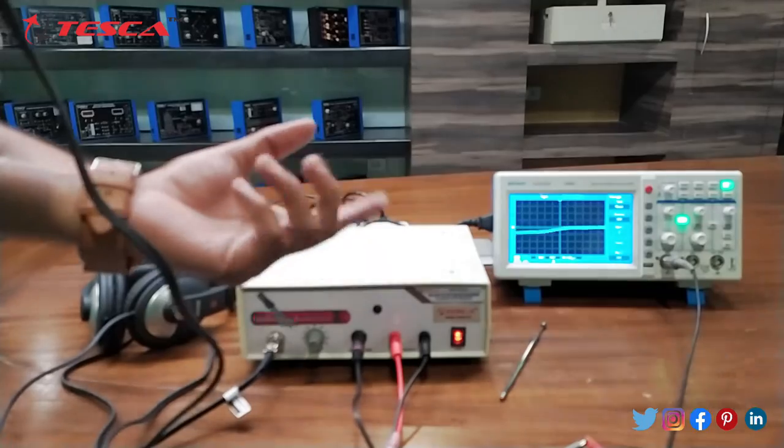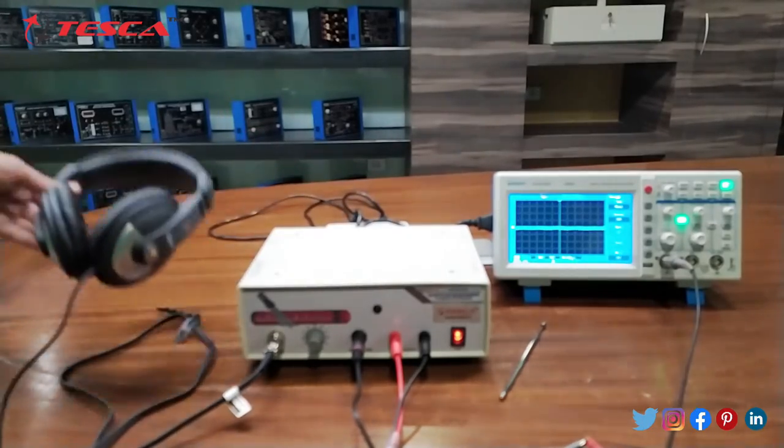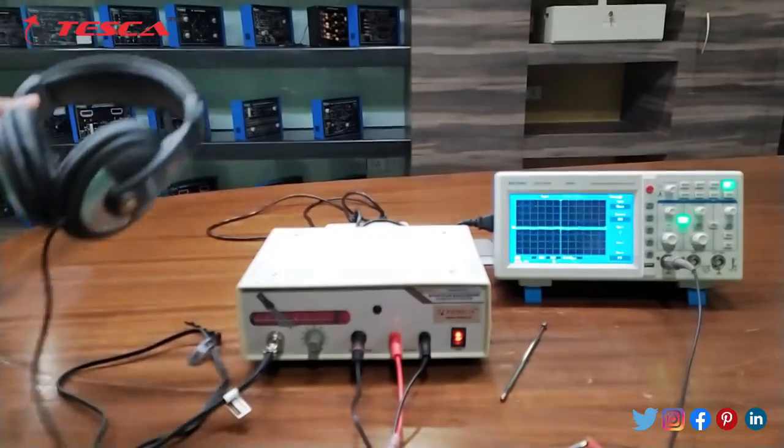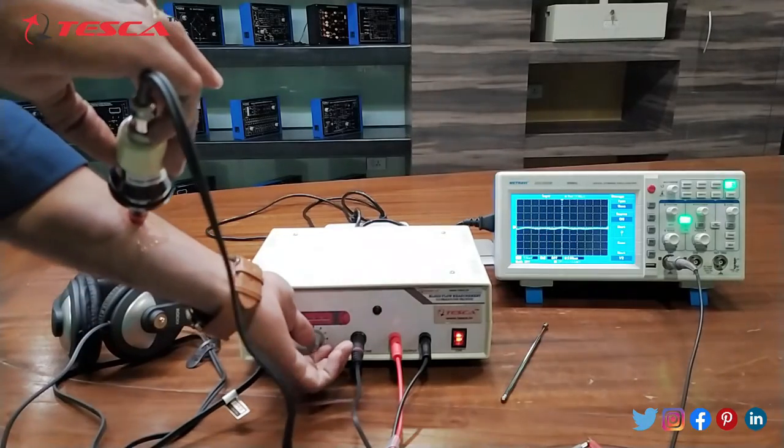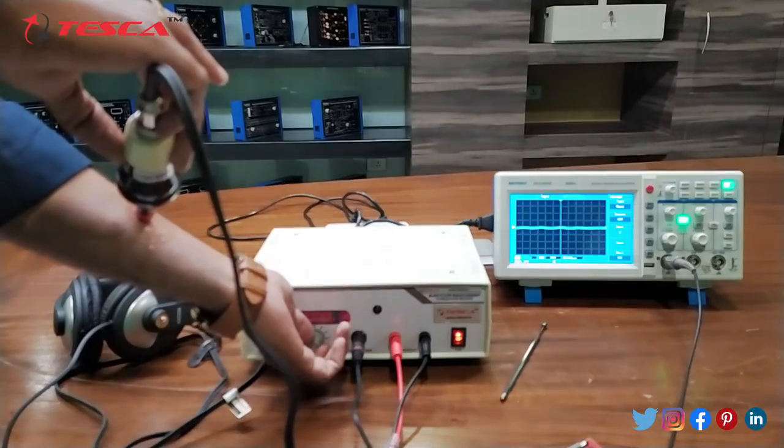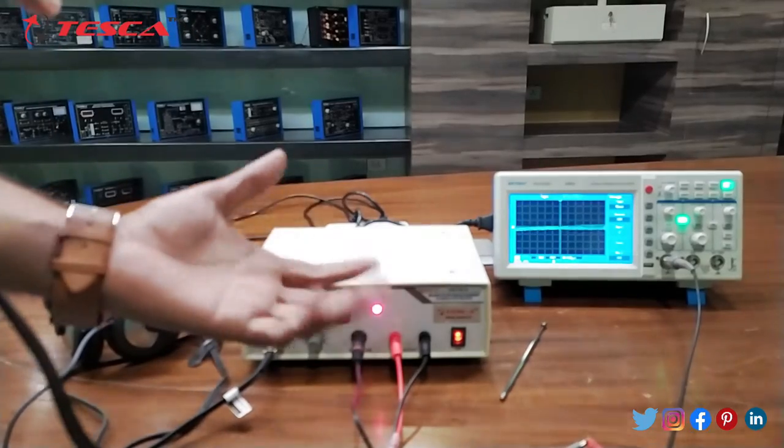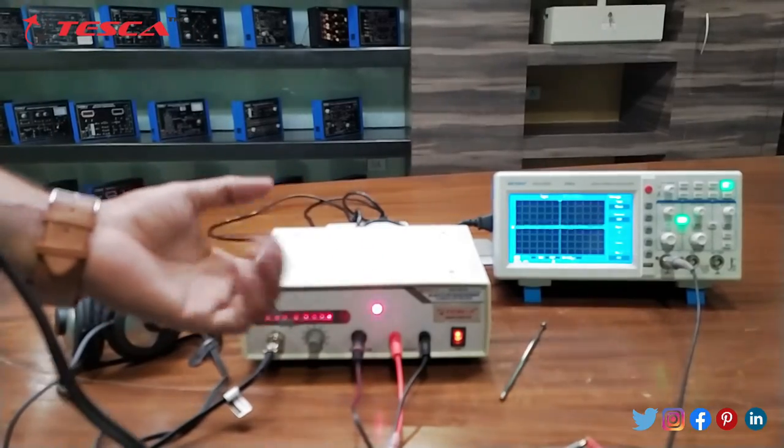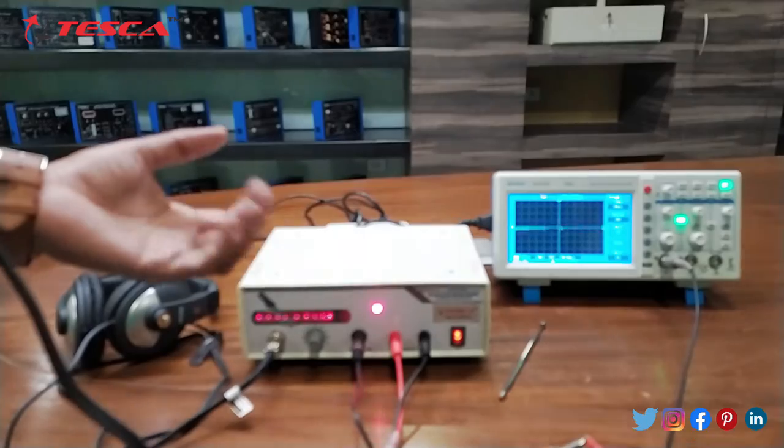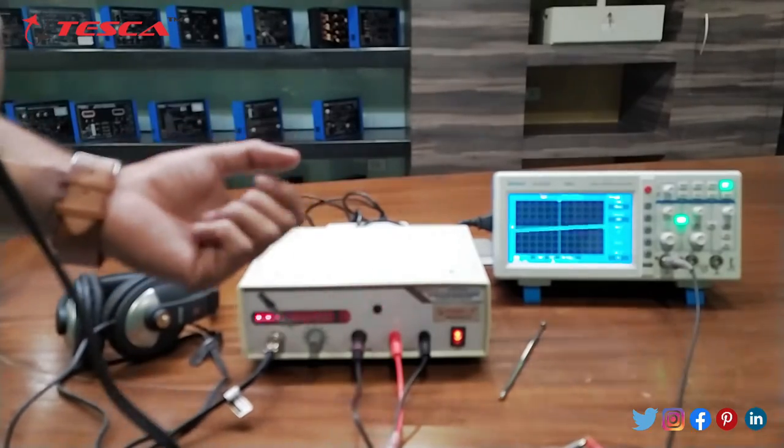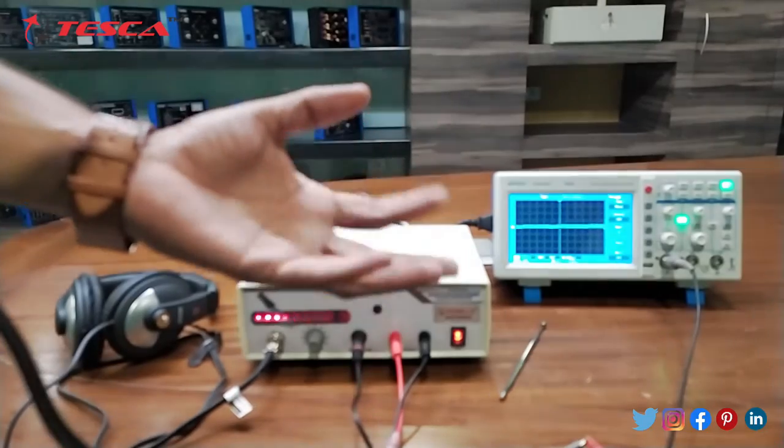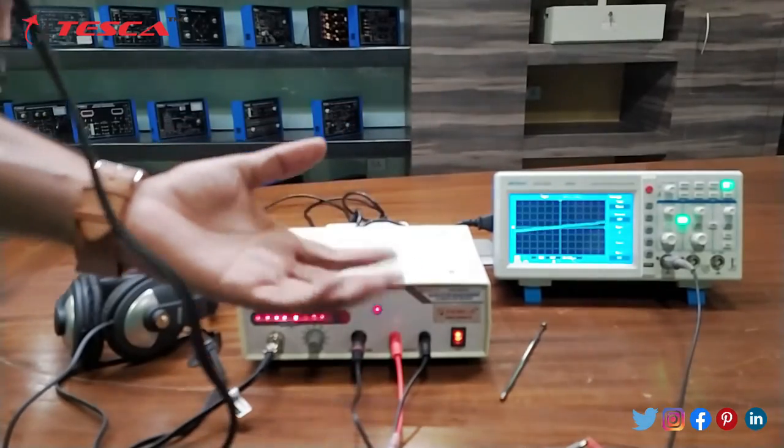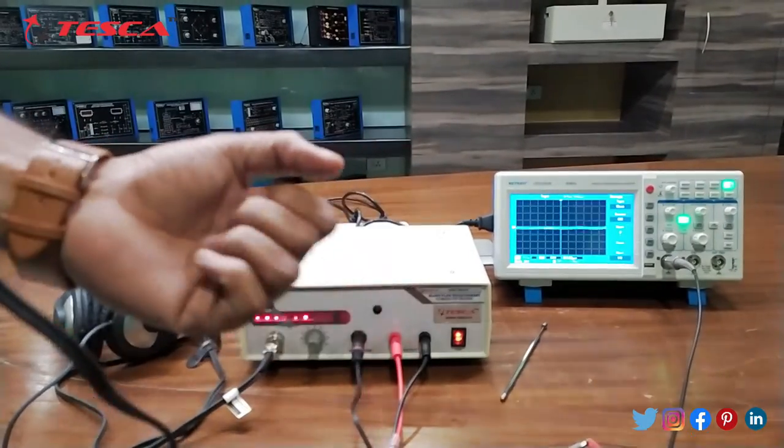And here we can see that on the DSO there is a movement which shows the blood flow measurement. And you can hear the sound through these headphones. And you can increase the audio from here. On the DSO screen you can see that the signal or the wave are propagating. This shows the blood flow of our body.